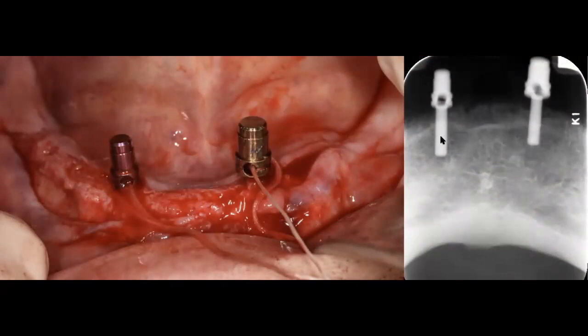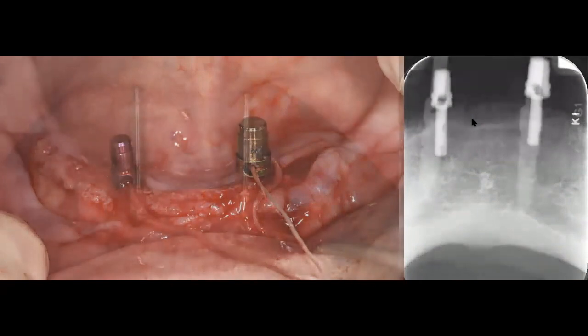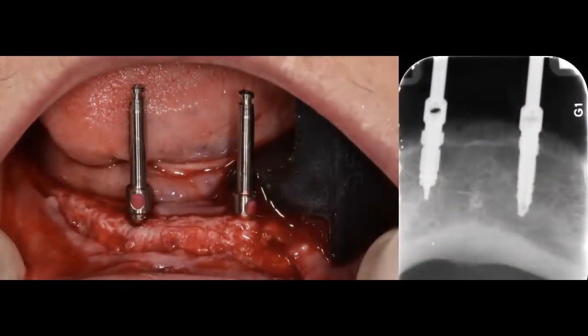So we did our bleeding points. We reflected our flap. We went ahead with the pilot drill, the 2.0 drill, one on each side. We removed the drill, removed the guide, and then placed our paralleling pins and took some x-rays so that we can make sure that we're parallel one to the other and that our locations are the ideal locations. And after that, we just go ahead and continue with the drills.